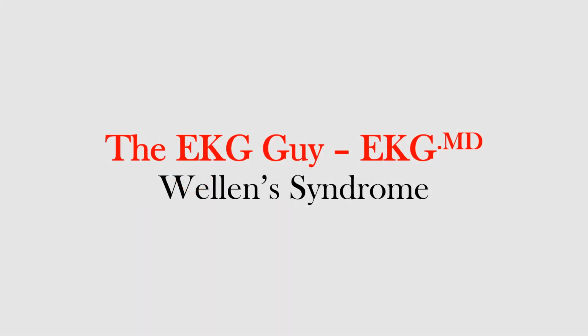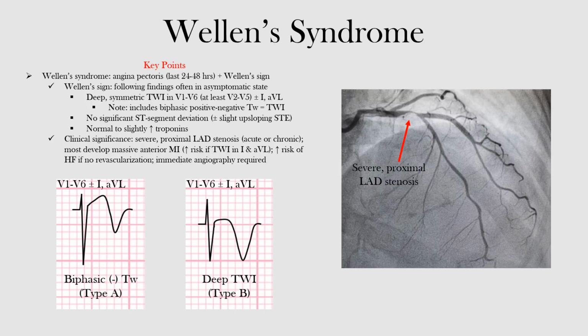In this lecture, we will discuss Wellens syndrome, including its EKG features and clinical significance. Wellens syndrome occurs in patients that have recently had angina pectoris, that is ischemic-related chest discomfort in the last 24 to 48 hours, but often present asymptomatic.